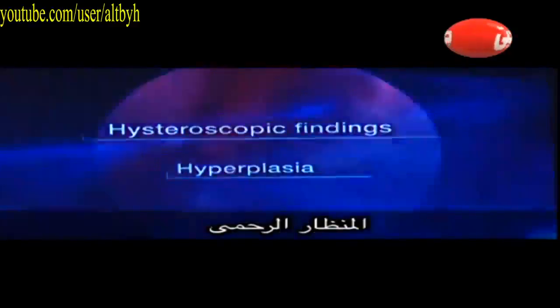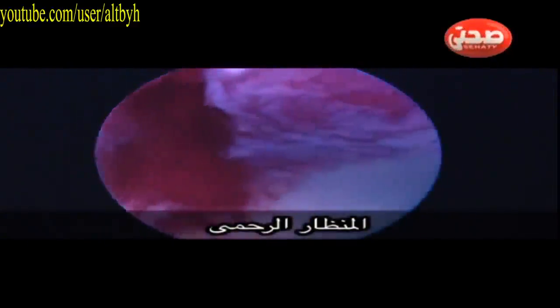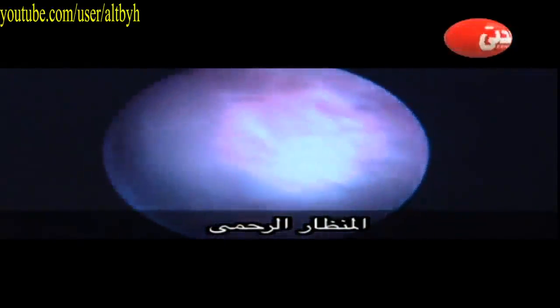Hyperplasia can also be found, especially for the ladies you suspect hyperplasia on ultrasound scan, mainly with perimenopausal bleeding or postmenopausal bleeding, and in this case you can see hyperplasia of the endometrium, and a biopsy is needed to decide further management and whether there's atypia or not.